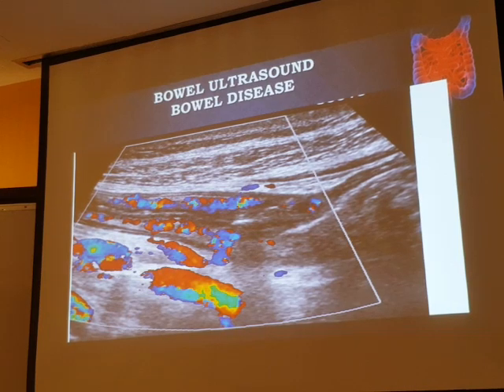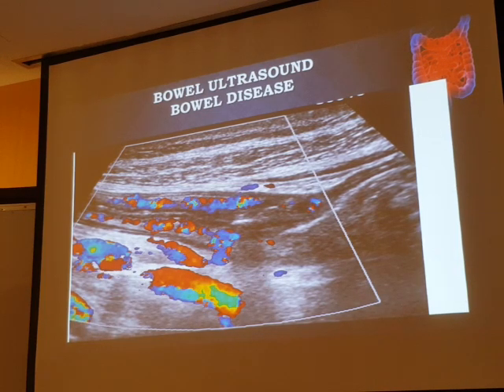Okay, so what is increased vascularity? This is increased vascularity. As you can see, it's inflamed bowel. The wall is echogenic and thick and hyperemic. Is the upper part normal or increased, all of it? Which one? This one? Yes. This one, no, it's the bowel, it's not the abdomen. This is the bowel only. Okay. This is just an inflammatory reaction, the inflammatory bowel appearance. This is what?